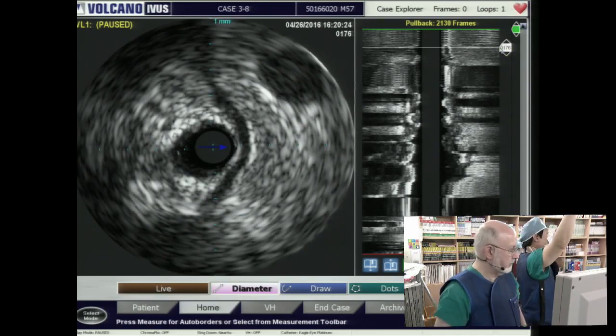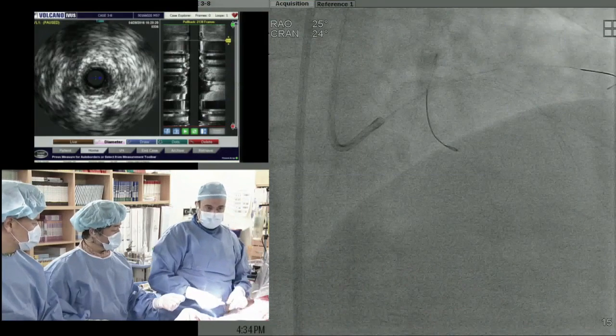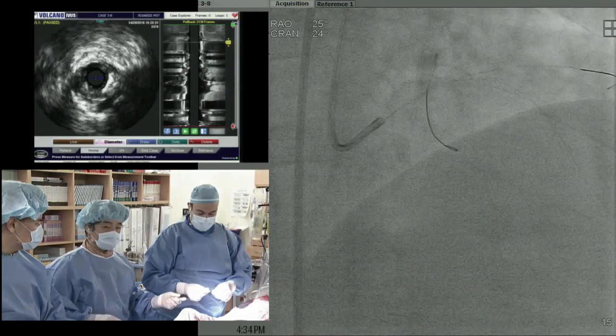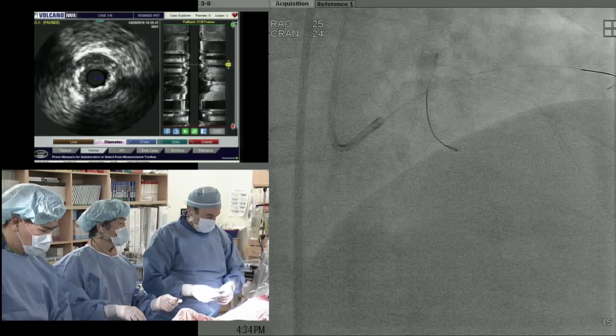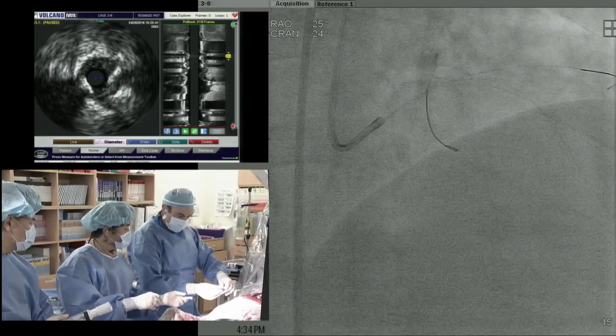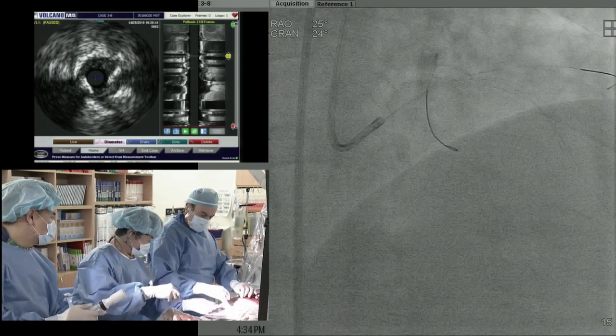I hope we stayed proximal to the muscle bridge. Yeah, I think you probably can. No, I put the first stent already, so we'll find out. We will find out if there's an explosion. Yeah, that's okay. I'm okay with it.